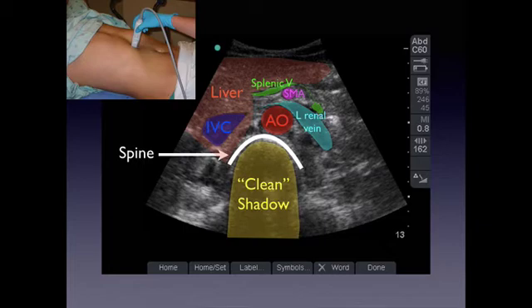So you can see that the left renal vein comes between the aorta and SMA, and that's, if you remember from pediatrics, you can get the nutcracker syndrome, and that would be where it's real dilated on that right side. I guess the left side of the patient, right side of the image. But you can see it's definitely a vein. It's attached to the IVC, and then you can see the splenic vein, and I just drew that little tiny line because it looks like it's compressed on that side, but I wanted you to realize that those green things are all one vessel.